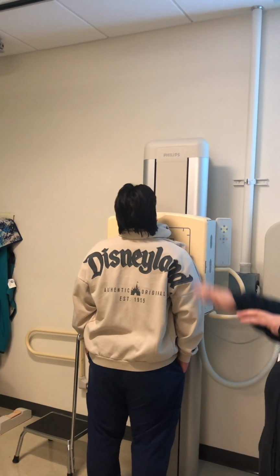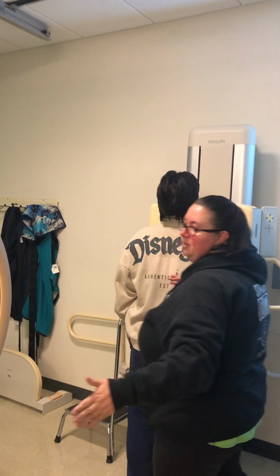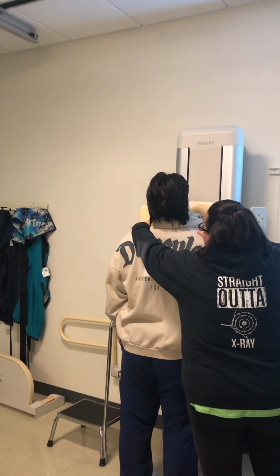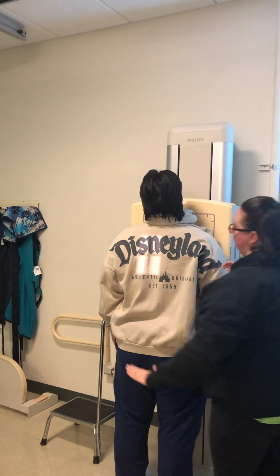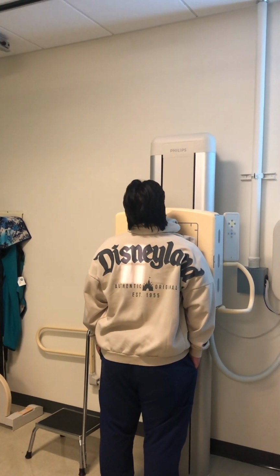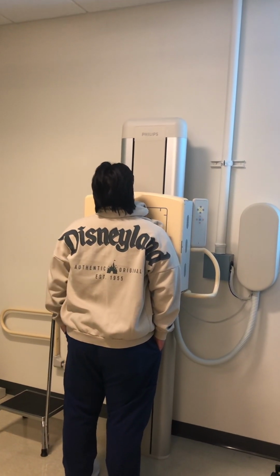Okay? So, again, posture is important. Make sure that stays nice and straight. And like I said, that you don't over-rotate, because 15 and then 20, if they're really skinny, is still not very much rotation. Okay? So don't make the mistake of trying to get their shoulder to touch, because that is far too much rotation. Okay? So, on this one, breathing instructions are going to be orthostatic breathing, which is what? Short breaths, so hyperventilating a little bit, yep. And we increase our time and decrease our mA, so we still have a nice picture at the end.